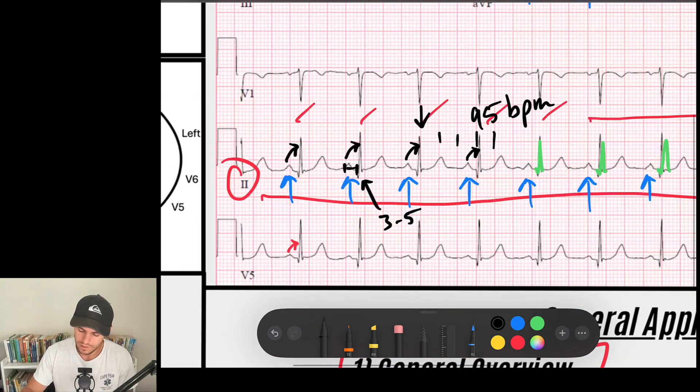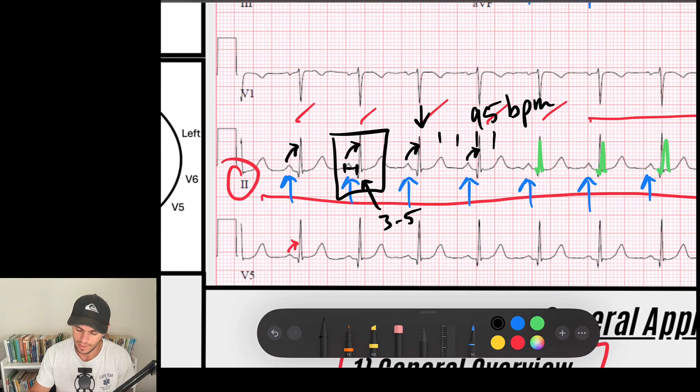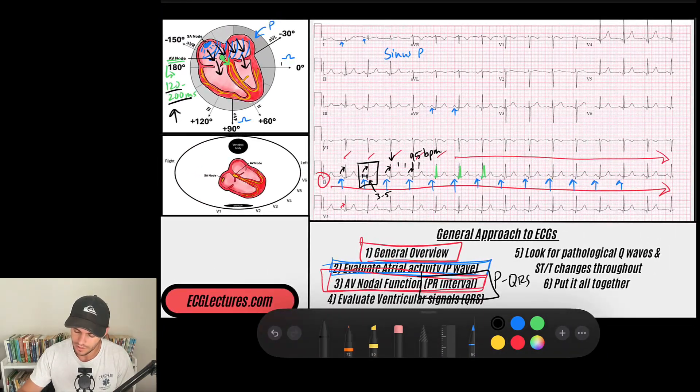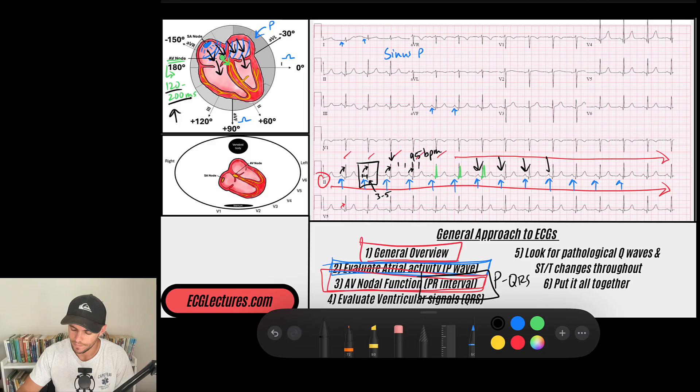Now, we just looked at this PR interval. That's only telling me how does the AV node work in this first beat that we looked at. But we need to obviously look at the PR intervals throughout the entirety of the rhythm to make sure that the AV node's behavior is consistent. And that's what we do here. I'm seeing a normal PR interval throughout the entire rhythm. I'm seeing every P wave going to a QRS. So in this case, that's how we would evaluate our AV nodal function. Now we're going to go down. And what's the next step?